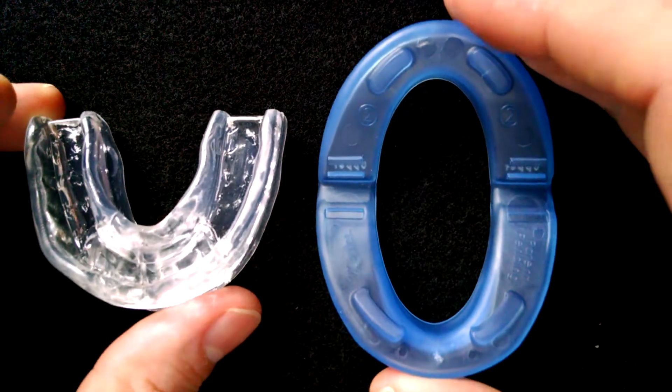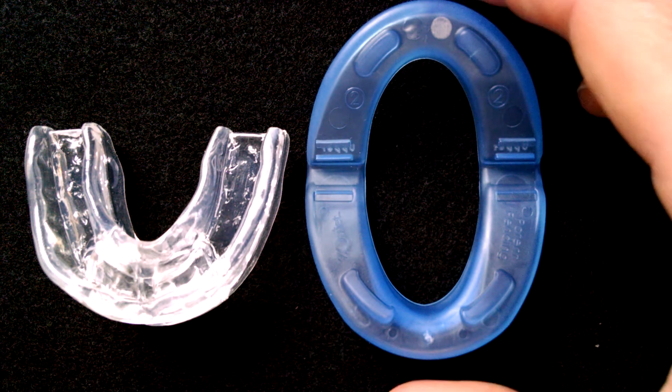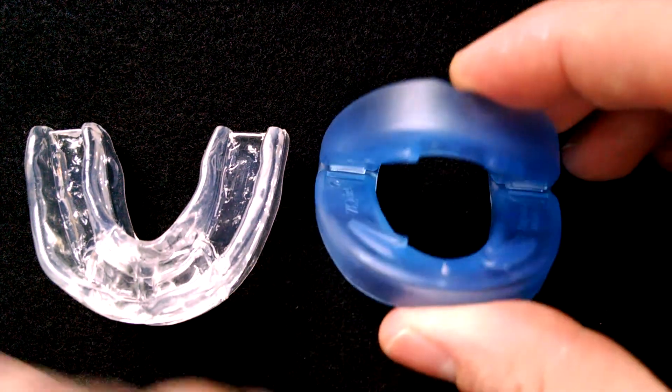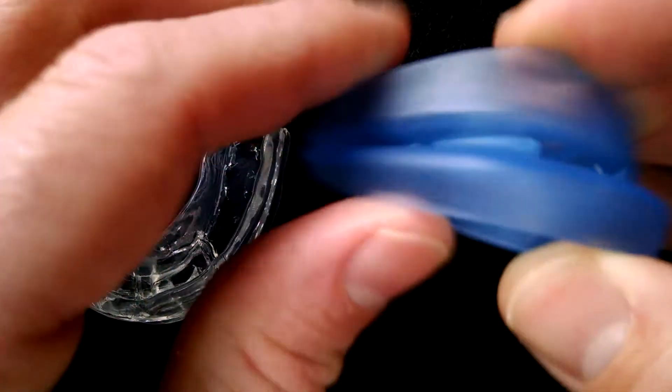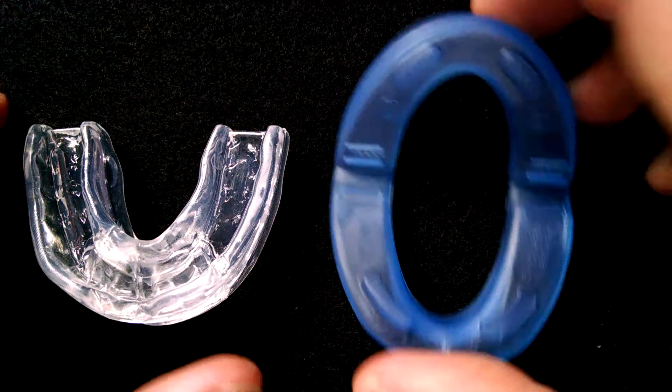This is the Rip Snore and Z-Quiet. They are two totally different designs. The Z-Quiet has a hinge design. It is a mandibular advancement device. It has a large breather hole here at the front and it's ready to use straight out of the box.